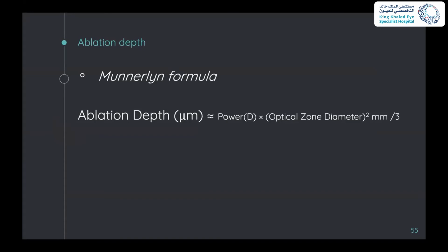In PRK, most of the references tell us the classic teaching is that it should not go below 400. Nowadays, a little bit lower than that, but not lower than 370. This is not a cut-off number, but just an idea.